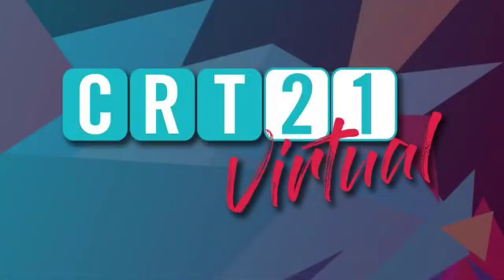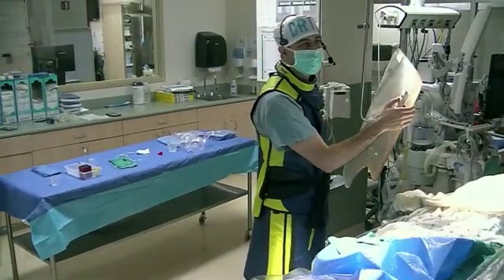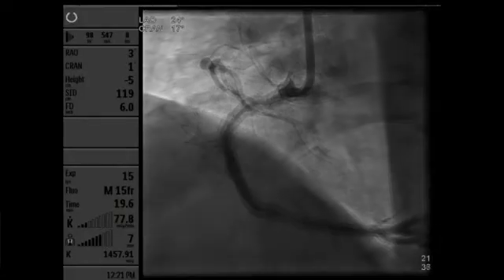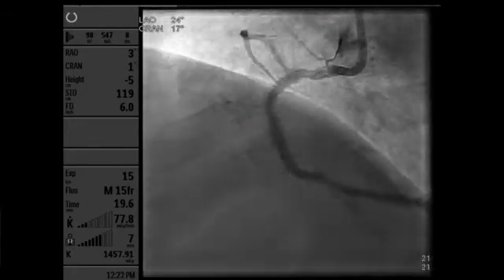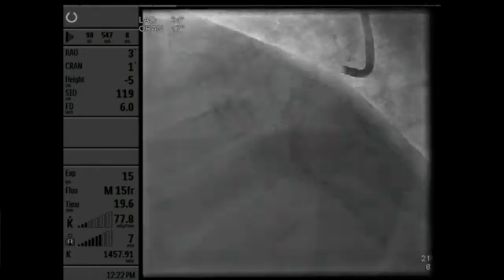We're going to move back to the cath lab at MedStar Washington Hospital Center. Hey there, Lowell, Heather, you want to summarize the case? Yeah, so we're all done here. I'm going to play the angio for everyone to see. Look at this. Wow, fantastic. I'm going to let that play while I get my OCT back up, and we will review the expansion data and all things that we had. Can I have OCT on the monitor now, please?